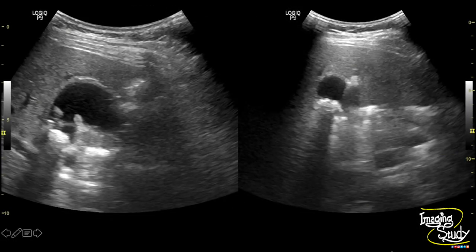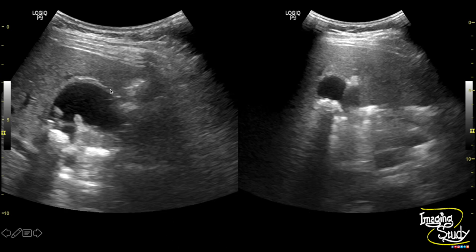Here is the picture of the gallbladder in longitudinal and transverse section. You can see the mucosal fold here and hyperechoic calculi casting posterior acoustic shadows. The gallbladder wall is still not thickened.